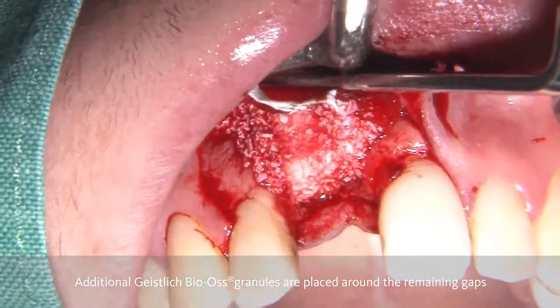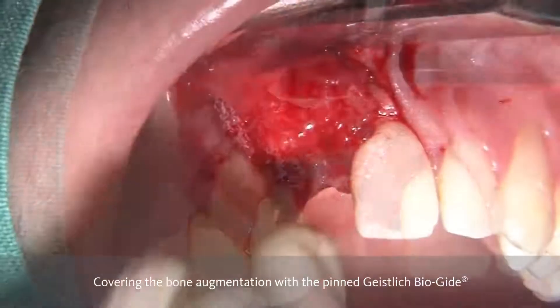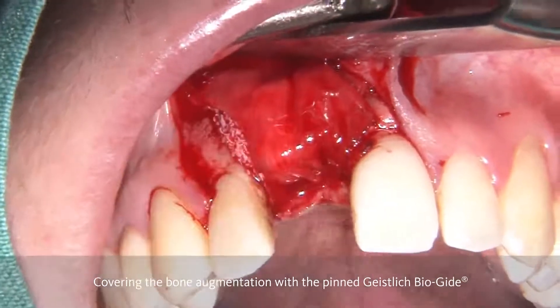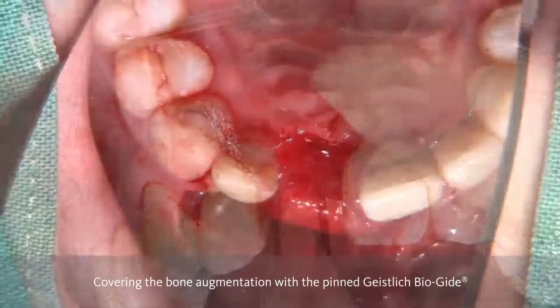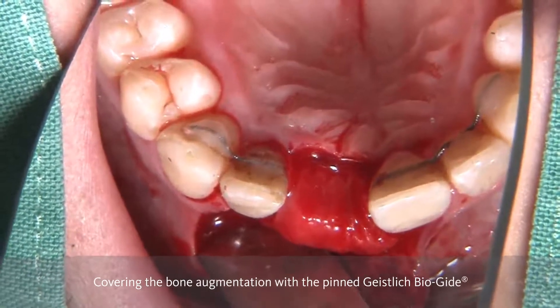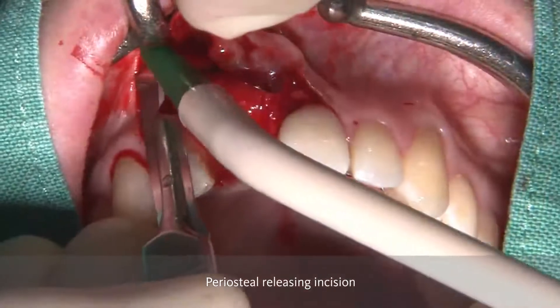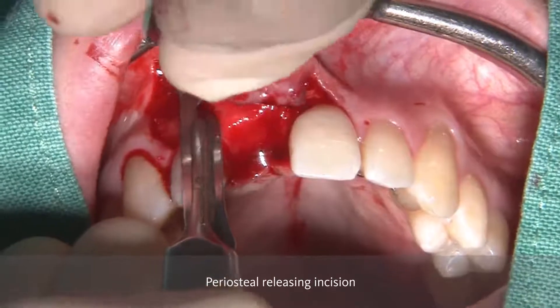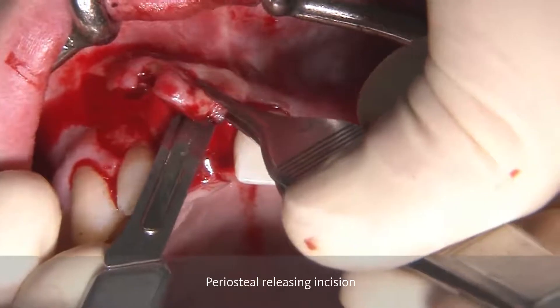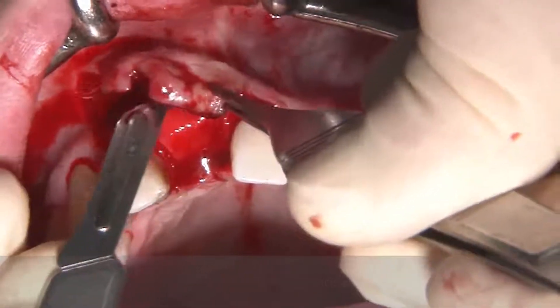With some granules around, you can smoothen the margins. And as the membrane is tacked, you can now just put it underneath the palatal flap and you have a very stable augmented area. You can also nicely see the amount of stability we achieve with this technique, and we have more volume in the crestal part where it is of utmost importance for aesthetics in this transition zone between the soft tissue and the crown.